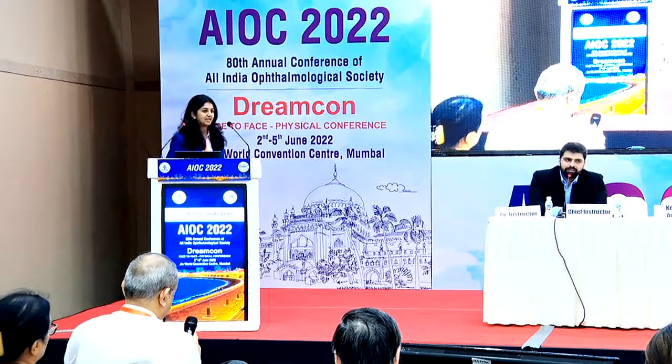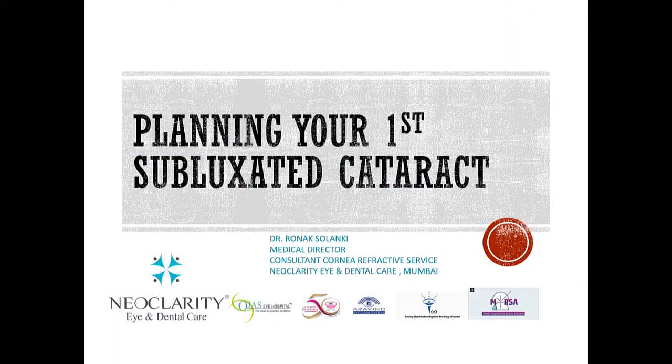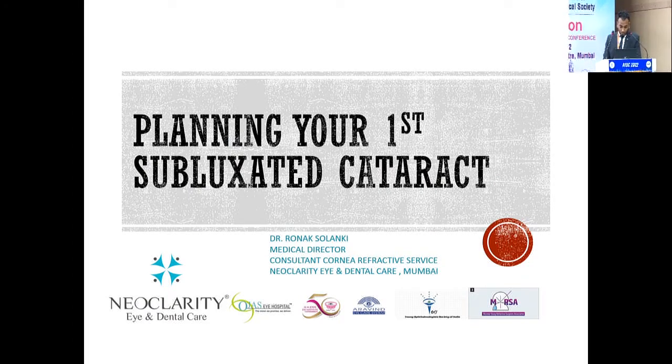Thank you, Prajakta. Our next speaker is going to be Dr. Ronak Solanki, who will be speaking on my first subluxated case. Hi, good morning everyone. So I'll be presenting how would you go about doing your first subluxated cataract.